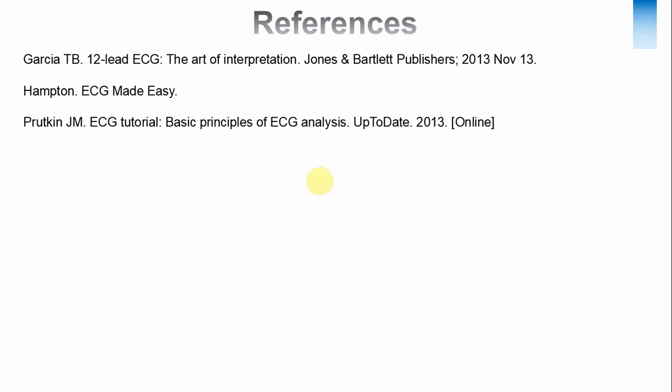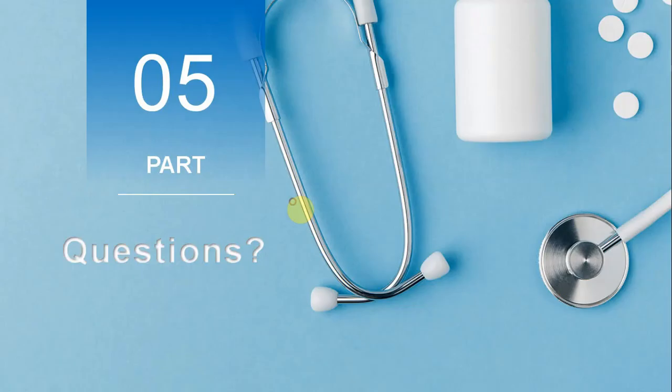there are hundreds of ECGs we can talk about. Over the next few weeks or few months, we'll go through those ECGs individually, and hopefully we'll have very good interpretation capabilities by following these steps.